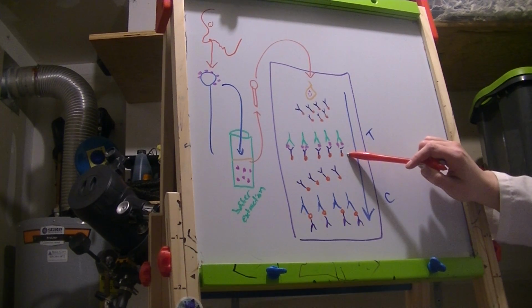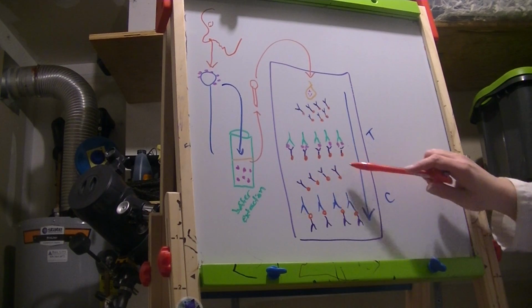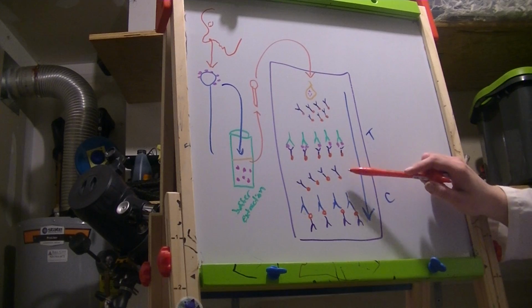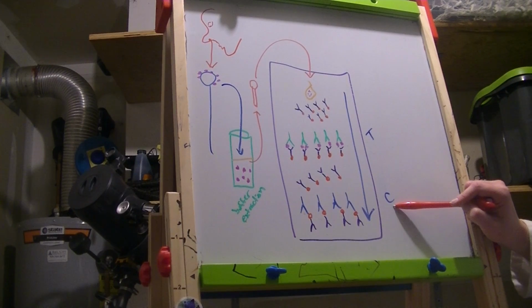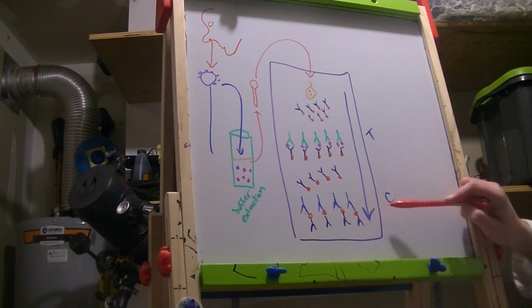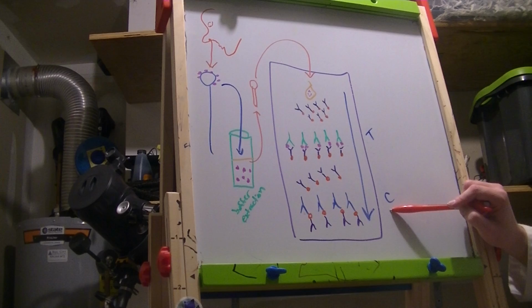Of course, there are always extra antibodies in the card, and so the extra antibodies that do not have the flu antigen attached will continue to travel down the card. As these travel down the card, they come to a place where the antibodies themselves will be bound by immobilized antibodies in the control area. They will cause the antibodies with their colored particles to stop in this area, and that's why we see a colored line in the control area.